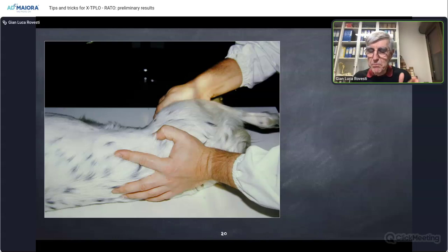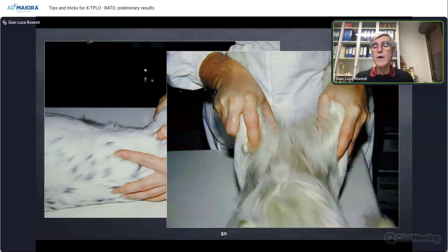So it is important to learn to apply this test during the surgery by performing it in a standard way, okay? Or in a dorsal recumbency. That's my standard procedure during X-ray examination.